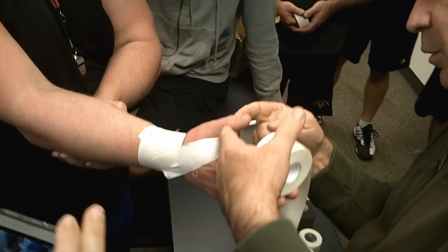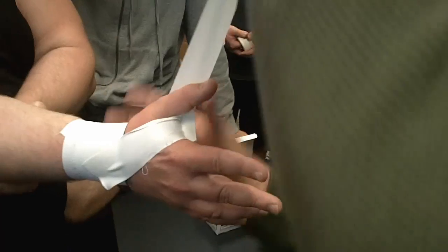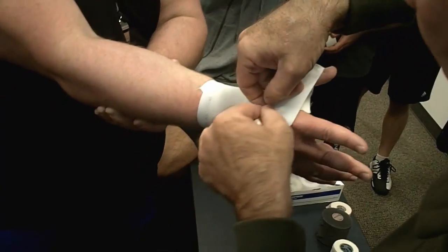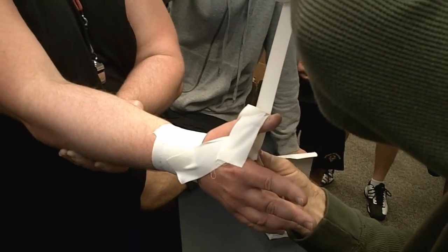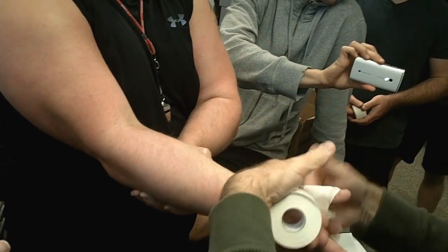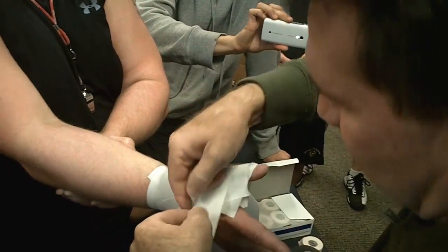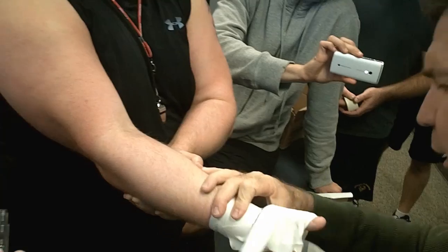We have to come out to the interphalangeal joint. I'm going to angle it like so and make a fold right there. Then I'm going to come up a little bit, fold that tab over, and overlap it again.